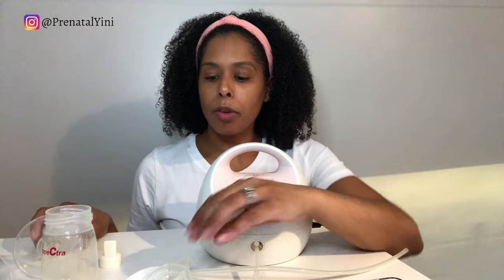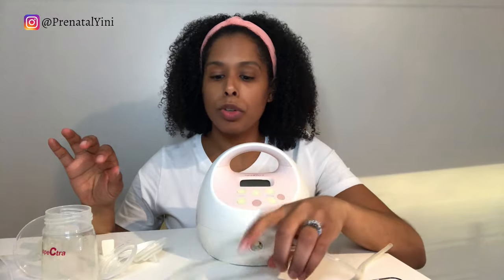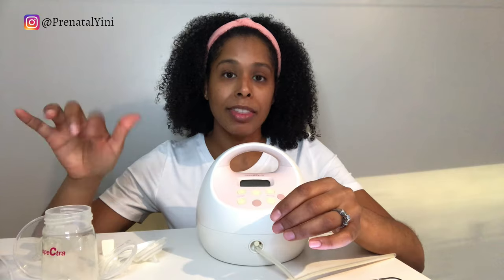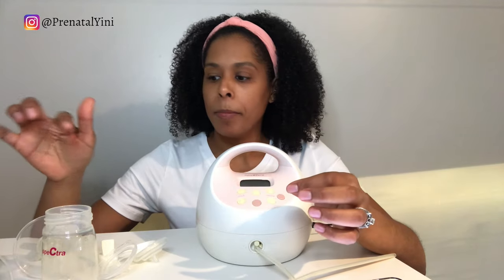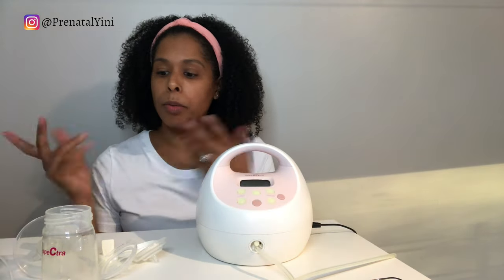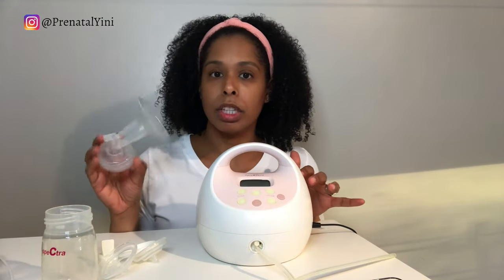Now we're going to wash the parts — except for the tubes, you don't need to wash those. Wash with warm soapy water, then sterilize for 10 minutes in boiling water or in a steaming bag, then let everything air dry. Once that's done, wash your hands and you're ready to assemble.